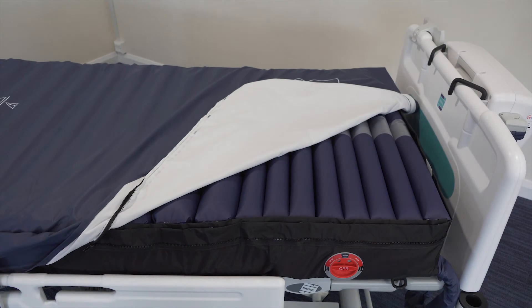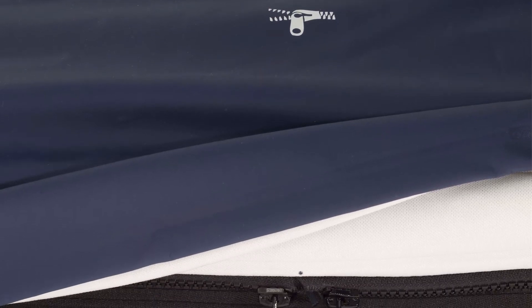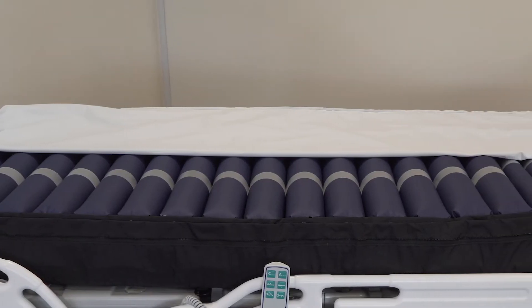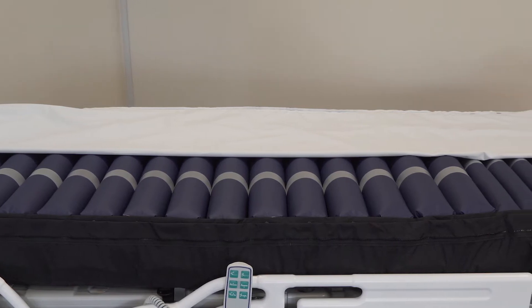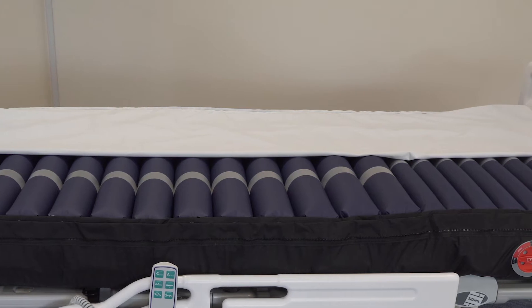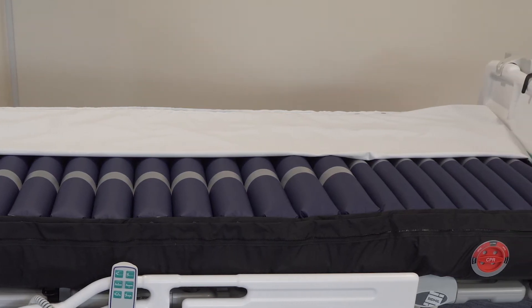The cover is multi-stretch, water resistant, vapour permeable, and has a high frequency welded seam. There is also a fully concealed 360-degree zip which reduces the possibility of fluid ingress and aids infection control. The mattress has a white inner substrate on the underside of the cover, which helps auditing procedures by making staining easy to identify if the cover has been compromised.